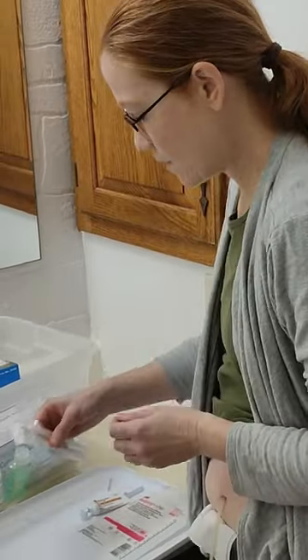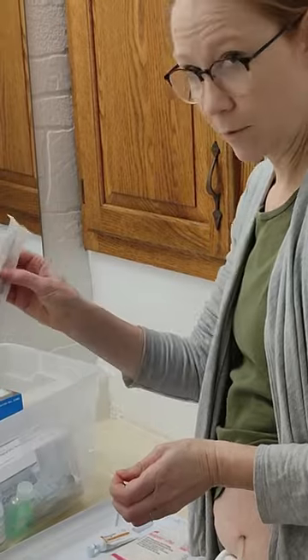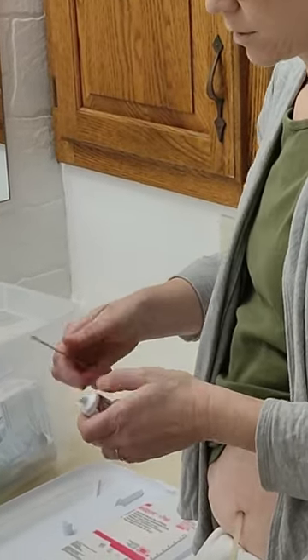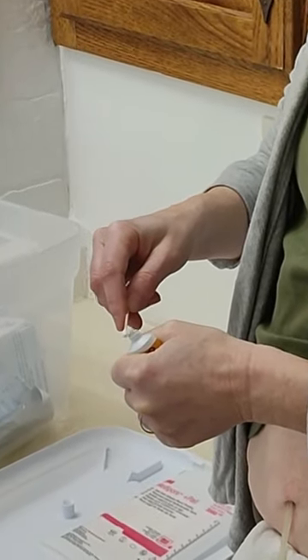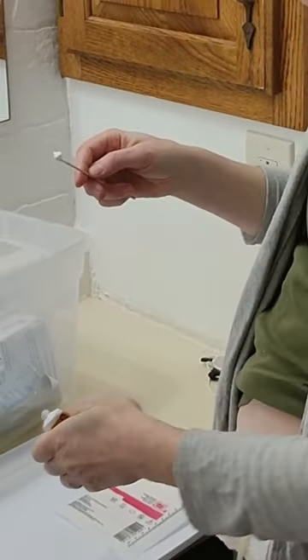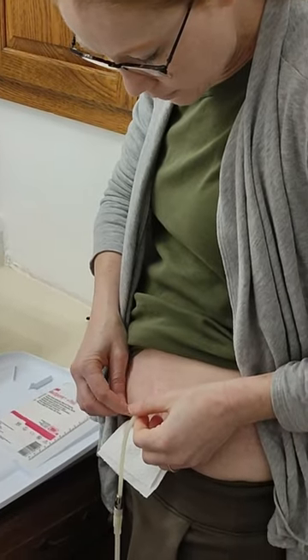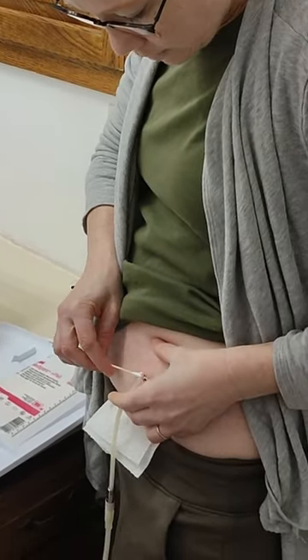Next we need to put on the ointment. I only pull out one q-tip and I set the other there so it's ready to go. And I go around and put it actually around the site.